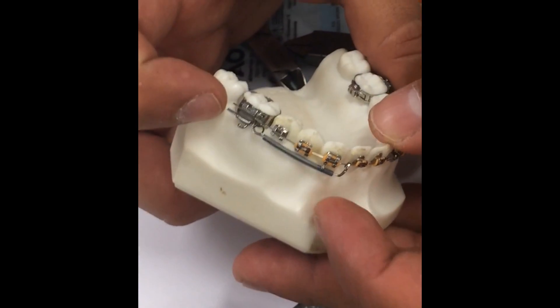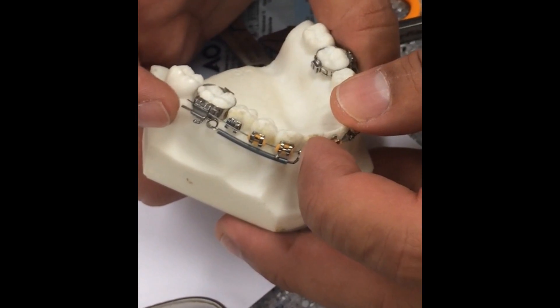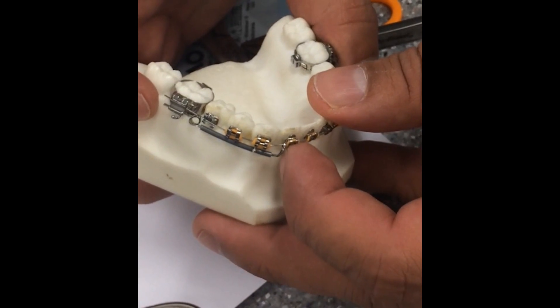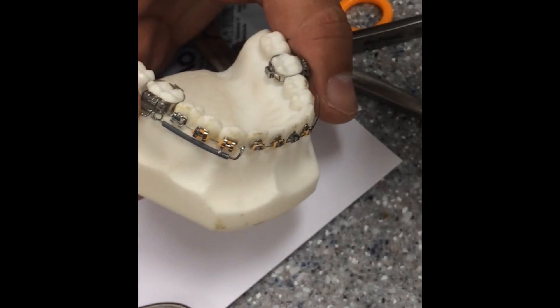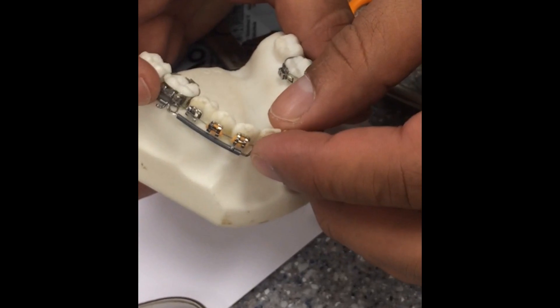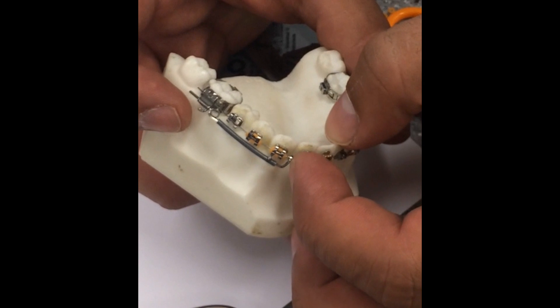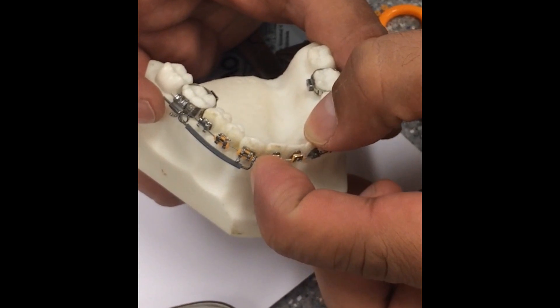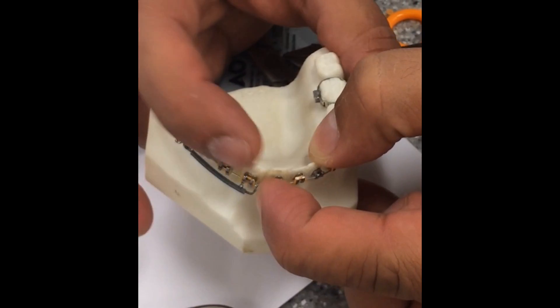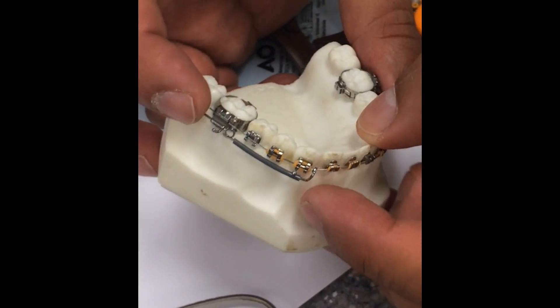Do not cinch back — you can cut it. It won't come off, because between the spacers it will stop here and here. So you cut it there, because as you're leveling the curve of Spee, the arch length will increase, and if you cinch it back it might hit somewhere you don't want it. If it gets stuck in the mesial of the canine and you cinch it back, it might not allow an increase of space — so if you have rotations on the premolars, you won't get the space. So you just leave it there.